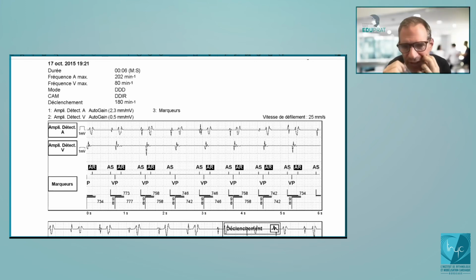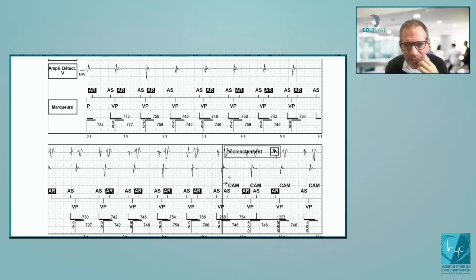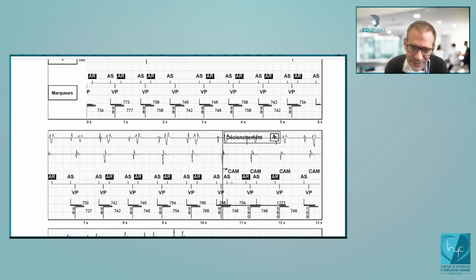So if you consider the filtered atrial rate, it will decrease by 40 milliseconds, increase by 20, decrease by 40, increase by 20. So with the alternance, every 2 cycles, you will decrease by 20 milliseconds, 40 minus 20. So if there is this kind of oversensing, at the end, you will have automatic mode switch. If there is a systematic oversensing of the ventricular pacing at the level of the atrial channel, you will have automatic mode switch. So that's a limitation of this algorithm, because if there is far-field oversensing, or this kind of thing, then you will have this problem.